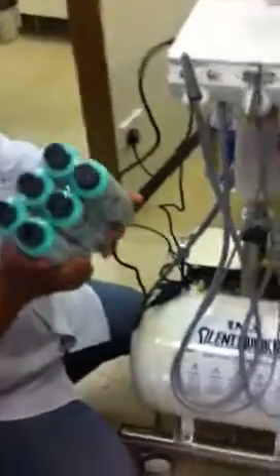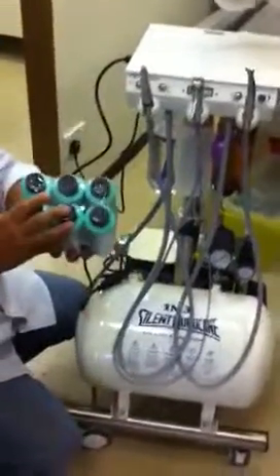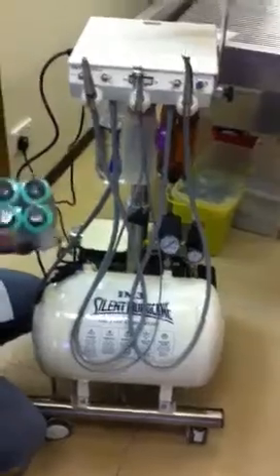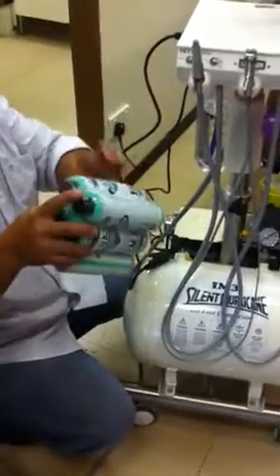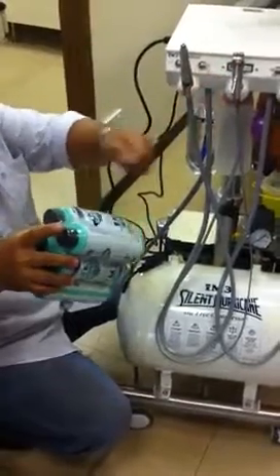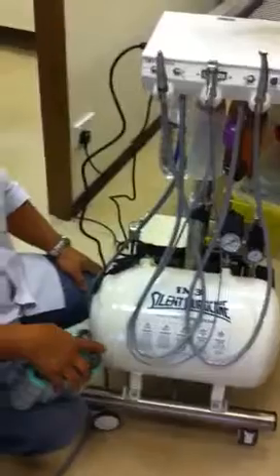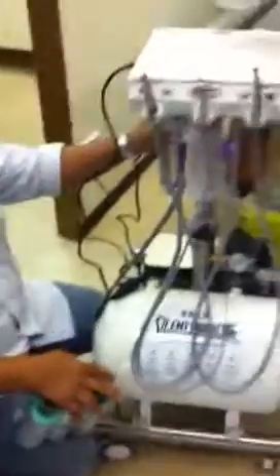When an animal first comes in, generally they don't smell very pleasant, like seafood. So what you can do is use the 3-way syringe to spray off and remove the smell. It's how when we go for our dental, maybe that's why they do that too. They spray and cleanse, disinfect, and so that's what the vets do.